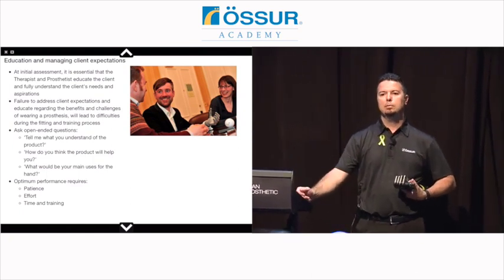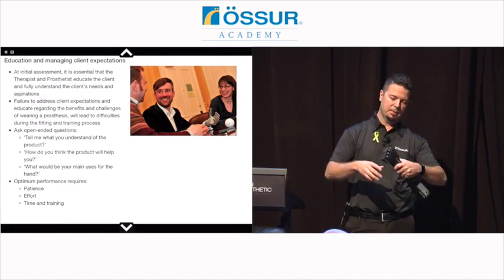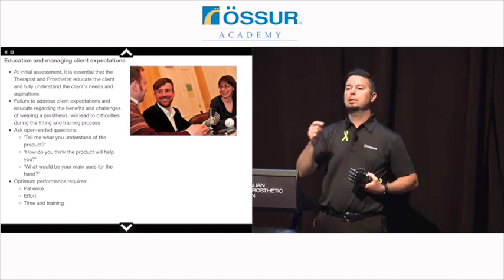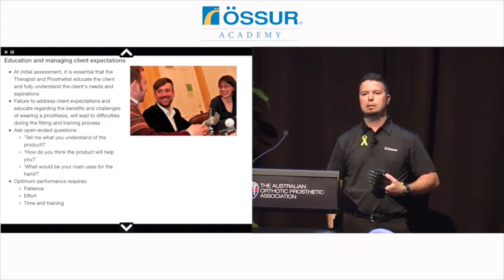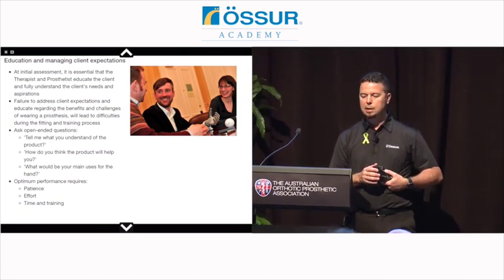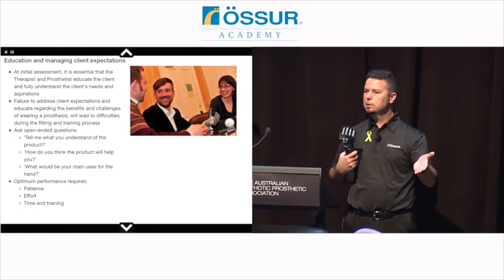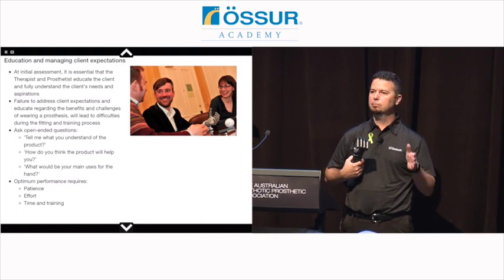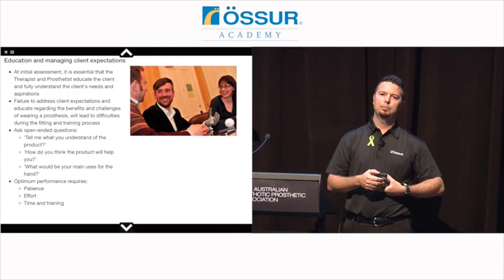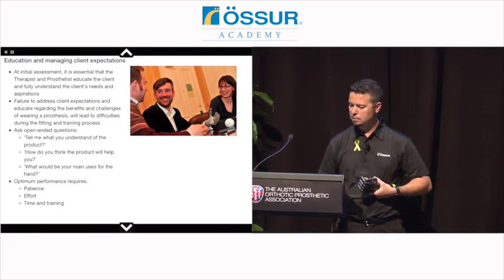In that case, that's when I would encourage them to carry a little activity notebook. Every time they stick an object under their arm to open it, or use their teeth to open a package, or something like that, write that down. Those are the kind of things that you can address and see if the iLimb hand is going to be appropriate for that. They also have to understand that this does take patience, effort, time, and training. If you were to pick up a new instrument or a new sport, you're not going to naturally be LeBron James or be able to play a concerto right away, right? It takes lots of practice, and that has to be emphasized as well.